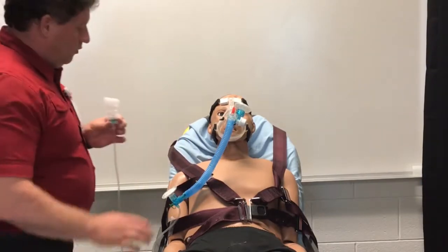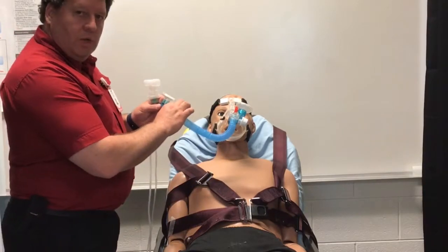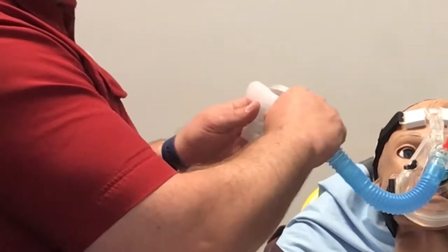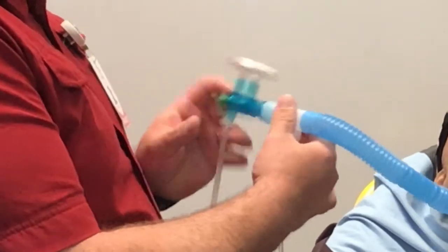You need this. So when your patient is hooked up to CPAP, at the end of the tubing here, you would disconnect it. This should then fit onto your T-piece, and then you can attach your oxygen there.